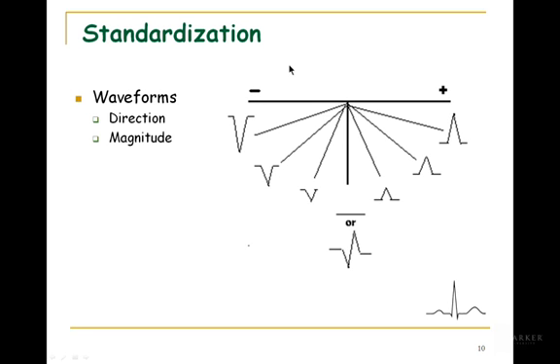If the wave of depolarization is running parallel to that particular view, that lead axis, you'll get the biggest deflection that you can possibly get.